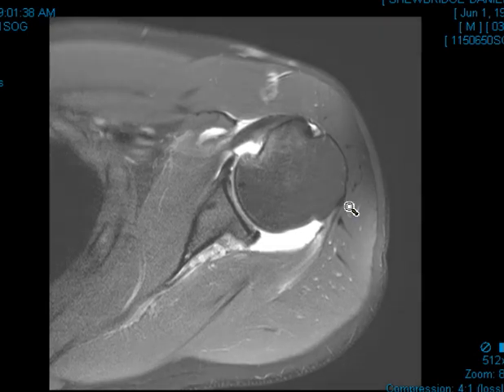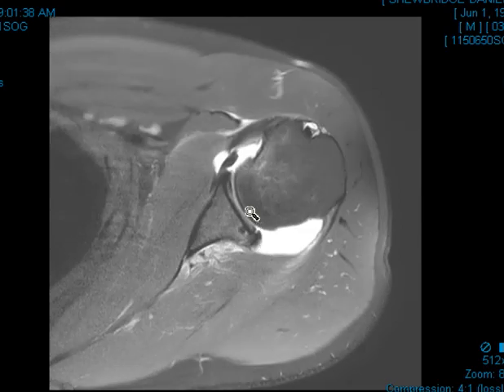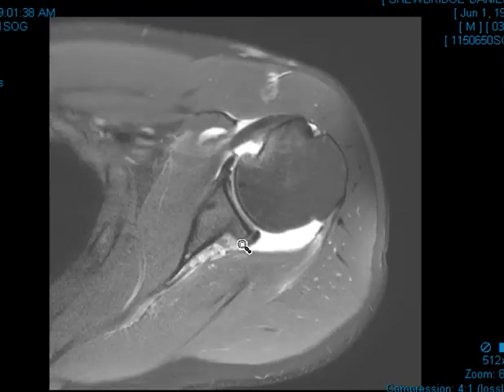On this view, we can see what is going on. Number one, we see that the cup here — the glenoid where the humeral head sits — is slanted backwards just a little bit. Instead of being straight or horizontal, 90 degrees to the long axis, it's sloped backwards, and we call it a negative glenoid version. You can see how when it's slanted backwards, the humeral head, instead of being held on nice and straight, is able to sublux posteriorly. The glenoid doesn't have a nice cupped appearance — it's pretty flat back here. This is an abnormal configuration called a posterior glenoid version.